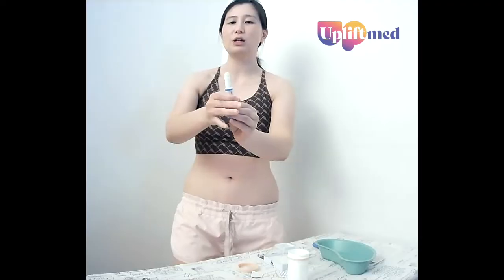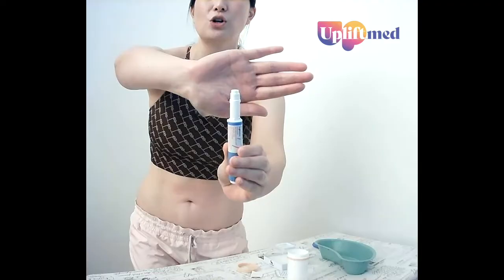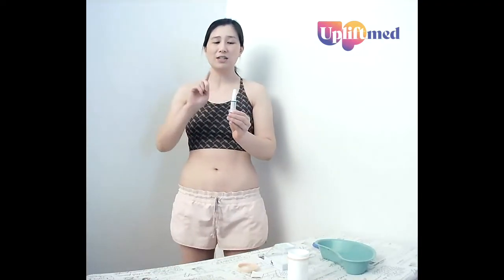You can already see — I'll just show you a close-up — that our needle is exposed and a little bit of fluid is starting to show through. This is good; it means that the needle isn't blocked and the fluid is free flowing.